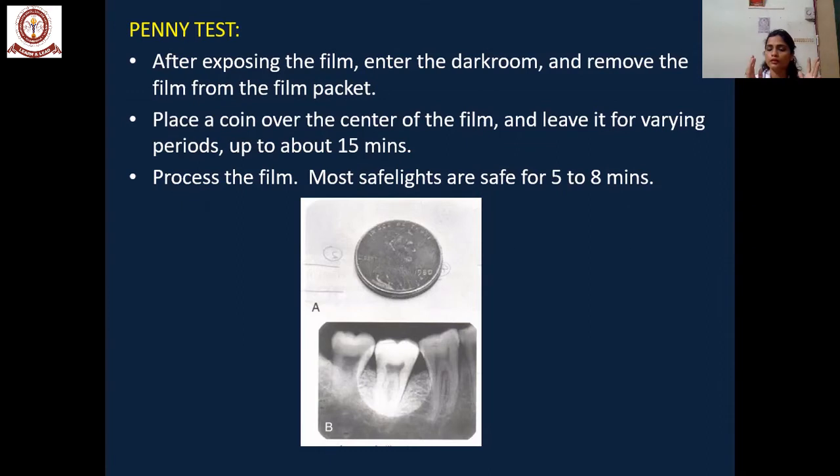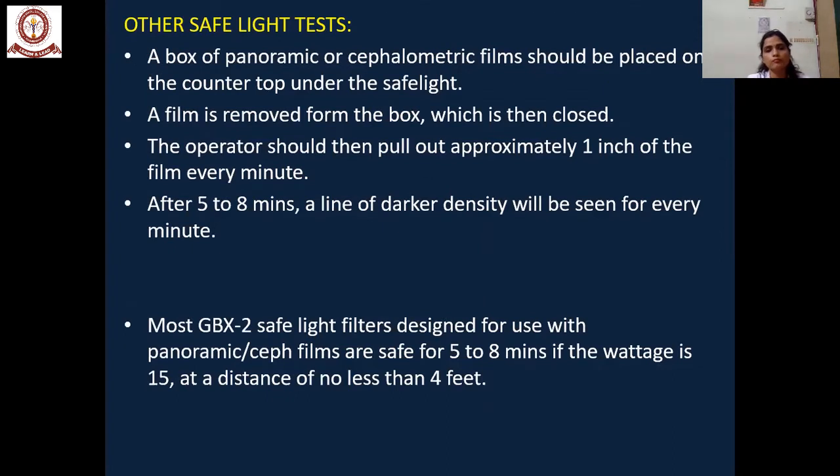That means the safe lights are exposing the film to regular white light so that you get the margins of the coin. So the penny test definitely helps you identify the safety of the safe light filters.